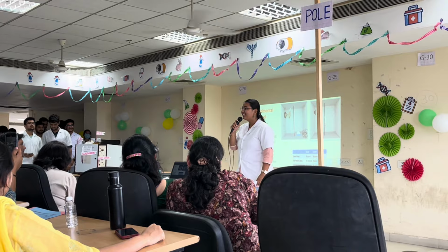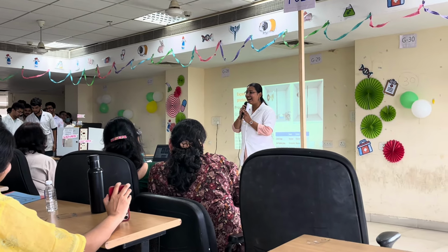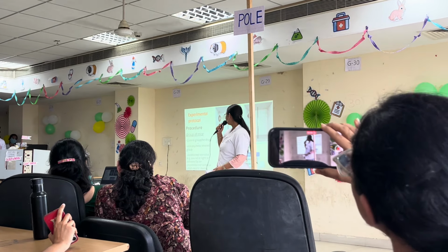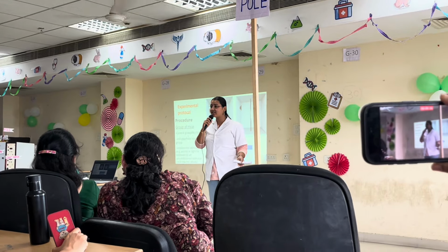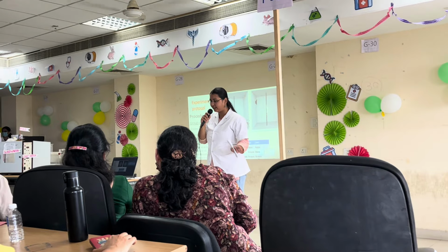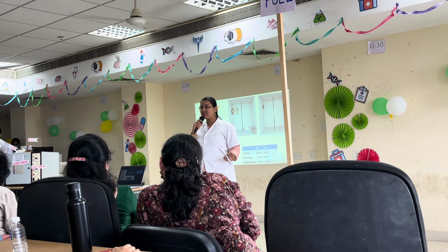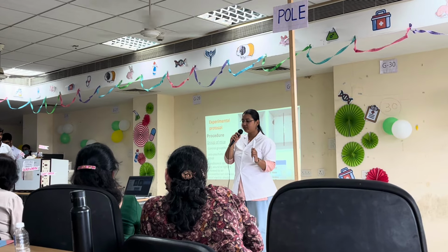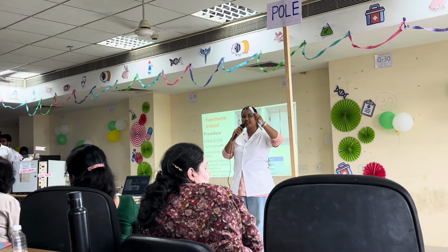Hello, yeah. So myself Shipra, also Chinky. So I'll further take over from the presentation. So the aim of this is to check the efficacy of the drugs which we use. The main drugs we use in this experiment are antipsychotic drugs and hypnotics and sedative drugs. So the procedure and the principle is as follows. We're going to do an experiment on the mouse. This is the mouse we have, and this is the pole.